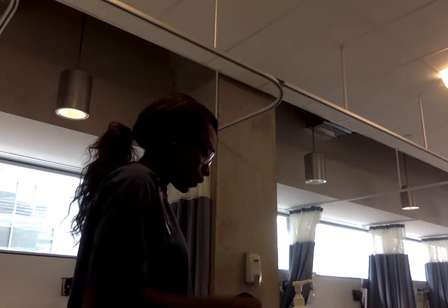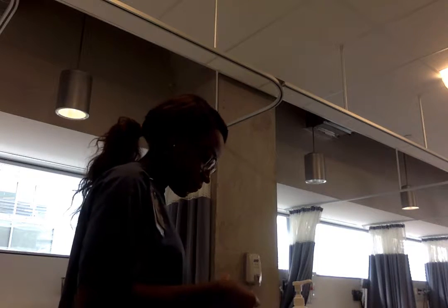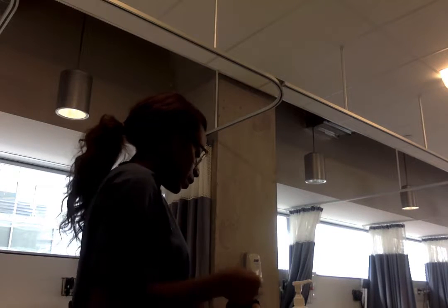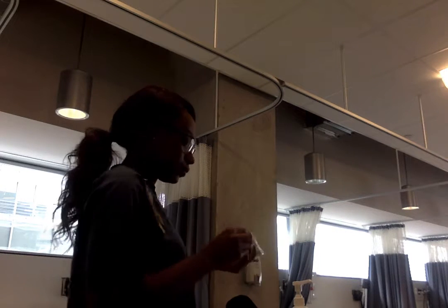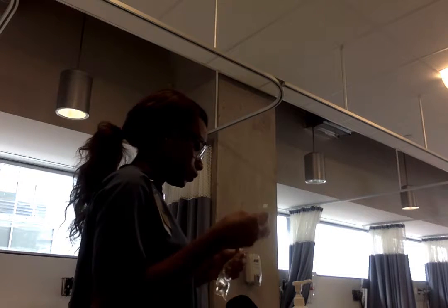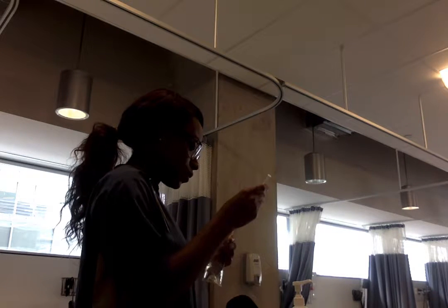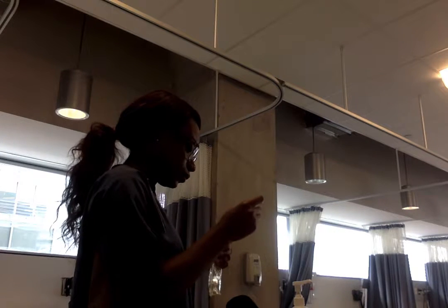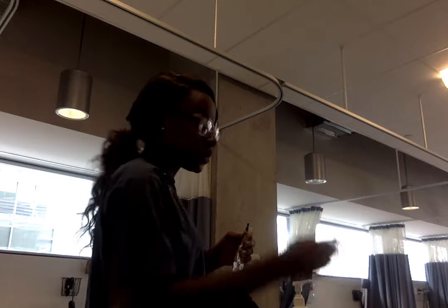So I also confirm that I have the correct medication, the correct dose, correct route, correct time again. So I clean my piggyback and insert the medication. Dispose of my needle.